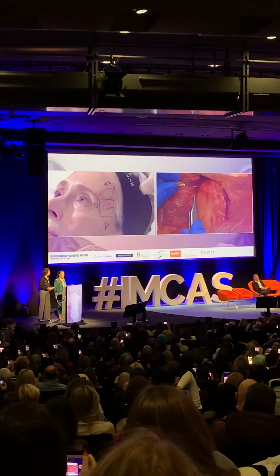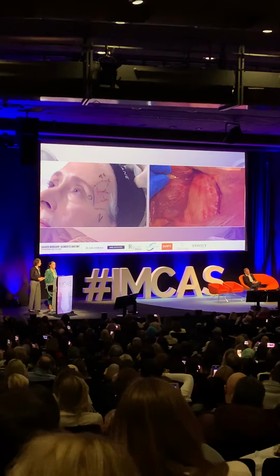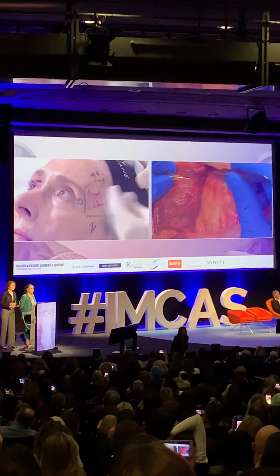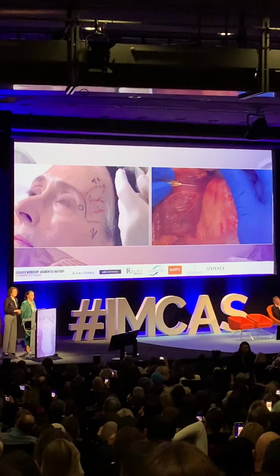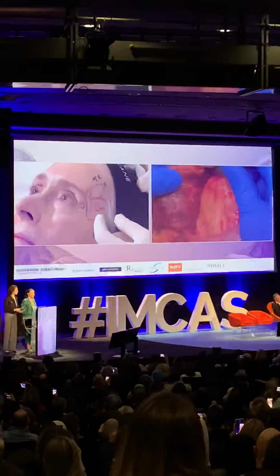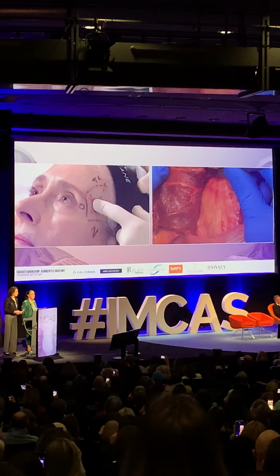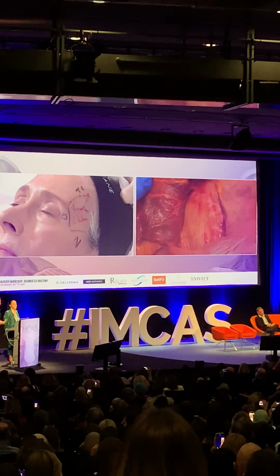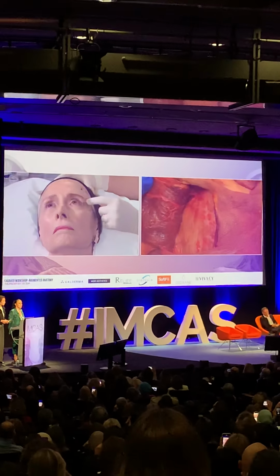And also, the little trick is that the needle that normally you have in the blister for all the products is a 13 millimeters length needle. And for the temple, sometimes the 13 millimeters length needle is not long enough to reach the bone.